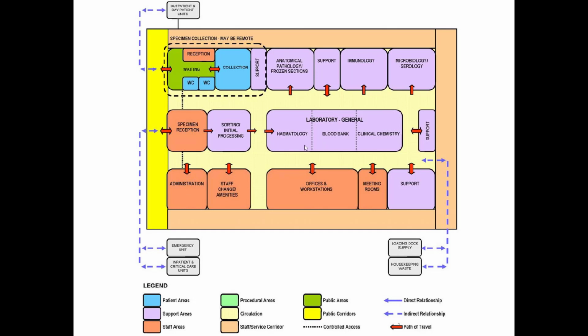The circulation and also the spaces have changed due to the advancement of technology, due to this new environment, a fully automated lab, which has made the pre-analytic phase and the post-analytic phase completely automated. So in addition to studying the analyzer, we need to study the automation in the pre-analytic and post-analytic phases in order to understand this new environment and its needs.